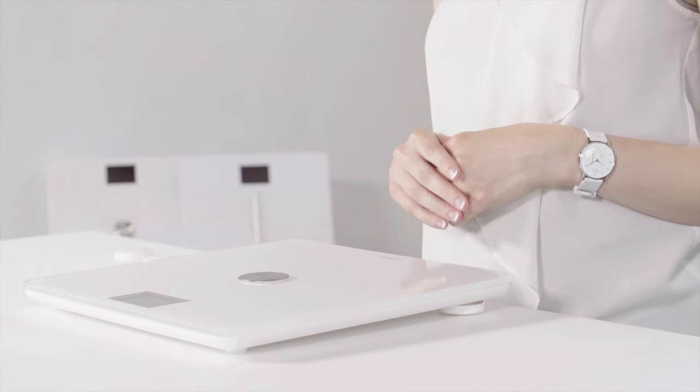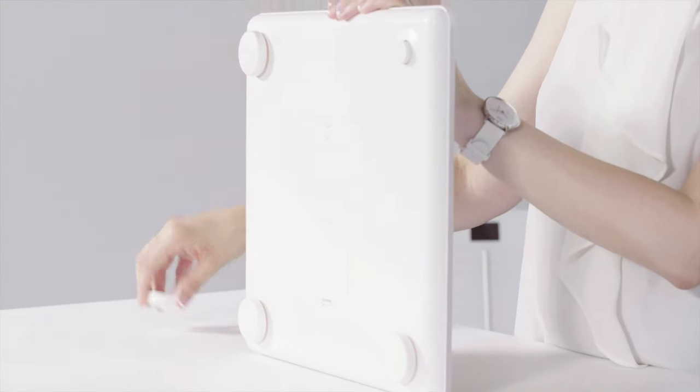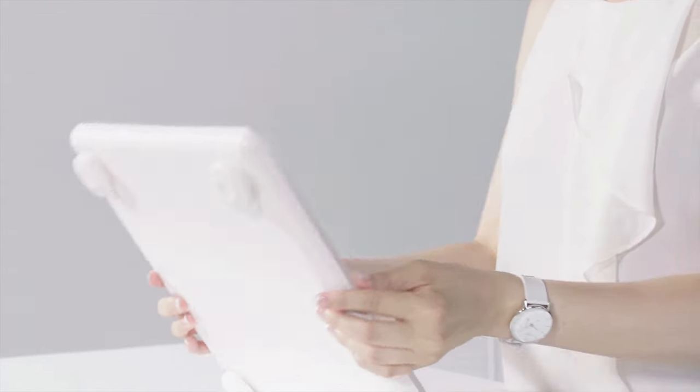First, place your scale on a level surface, such as a hardwood or tile floor. If you're using the scale on a rug or carpet and you use Withings Body, be sure to install the carpet feet to ensure an accurate measurement.